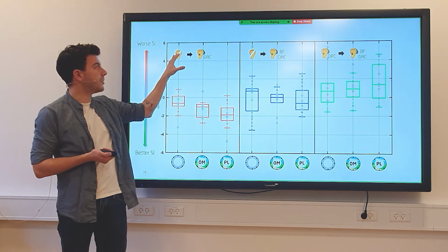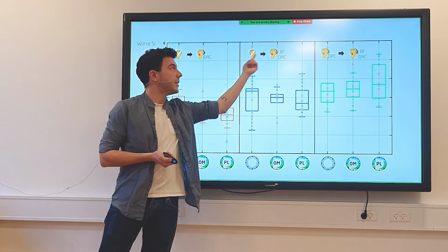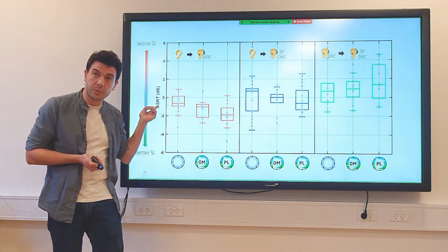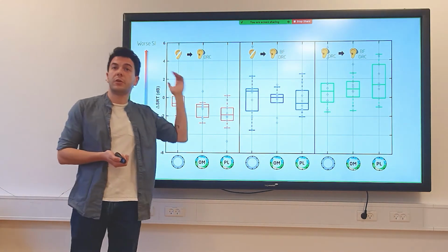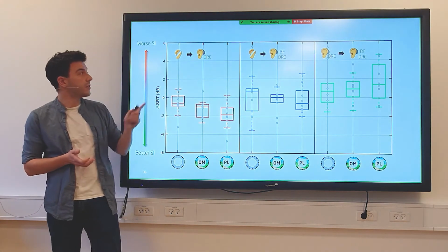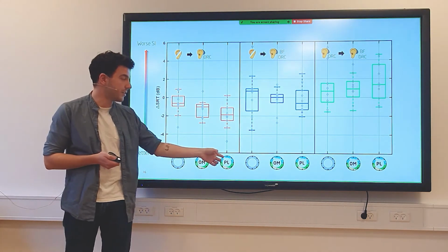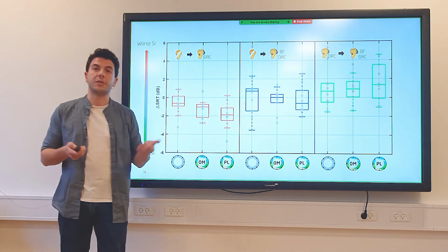So in the panels now you see the difference between unaided and hearing aid strategy 1, between unaided and hearing aid strategy 2, and then comparing the two strategies with the same conditions on the x-axis, but now showing the delta SRT on the y-axis, which indicates that if it's negative, performance improves, and if it's positive, it gets worse. Again, looking at the red box plots, you see that hearing aid strategy 1 improves speech intelligibility in all noise conditions, but more so in the realistic VSE. The hearing aid has more benefit in the realistic rendering of the critical sound scenario.